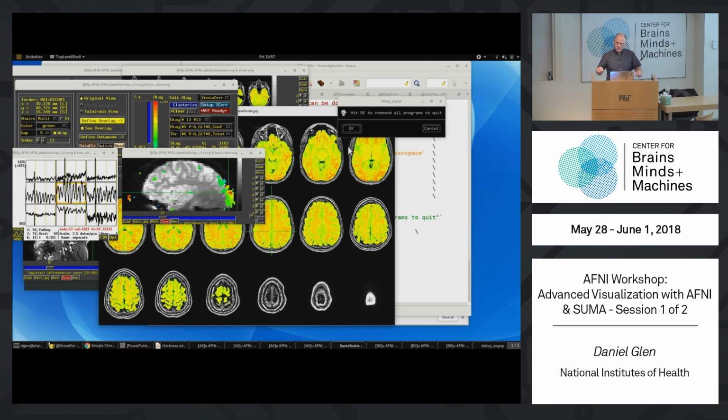Sorry, so that means that @drive_afni is a reserved script? No, that's... There are the agents, so yeah, we provide them as an example, but they're really made to go with our class data.